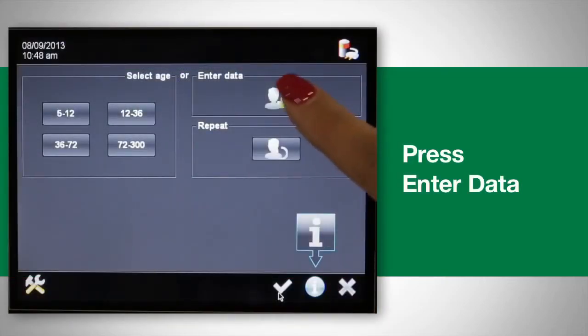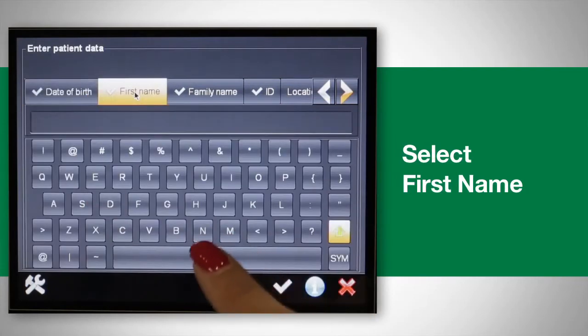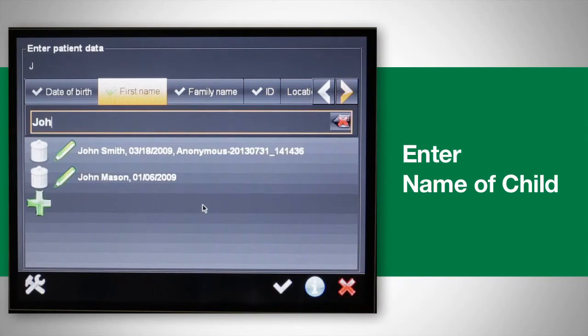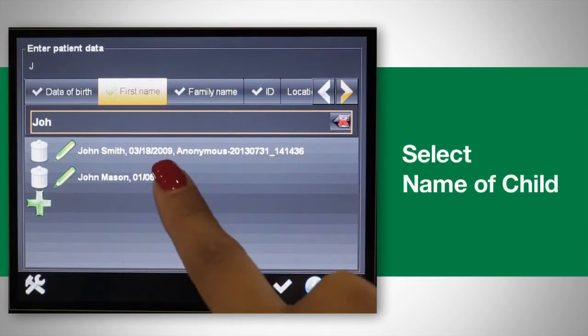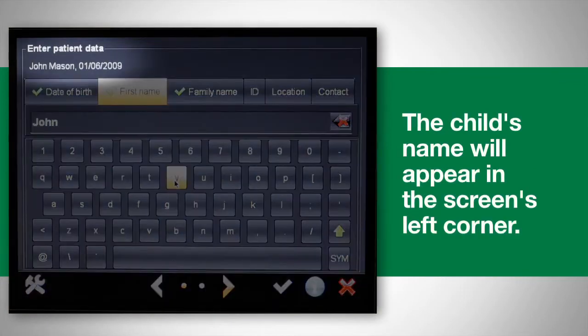To find a child's information, press "Enter Data," then select "First Name" and enter the name of the child. As you type, the device will attempt to match existing names in the database. Once the name of the child you are screening appears with the correct date of birth, select that entry. The child's name will appear in the screen's upper left corner.